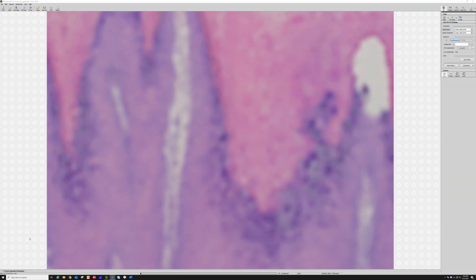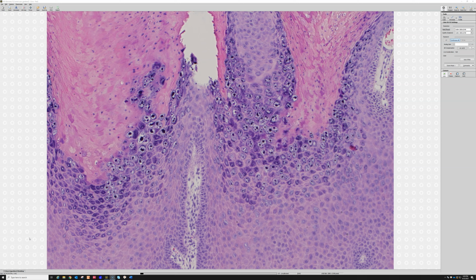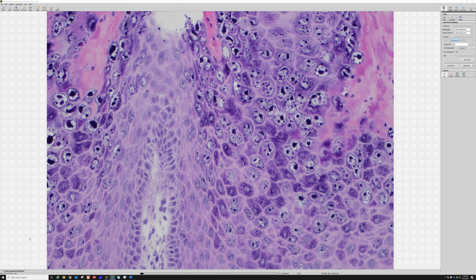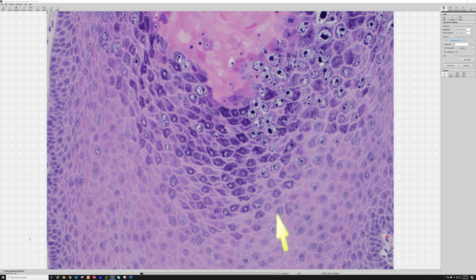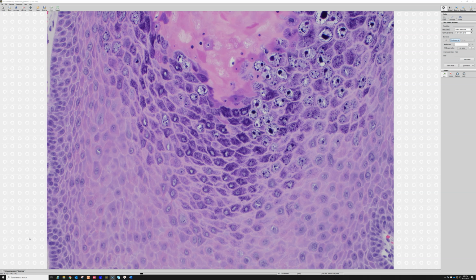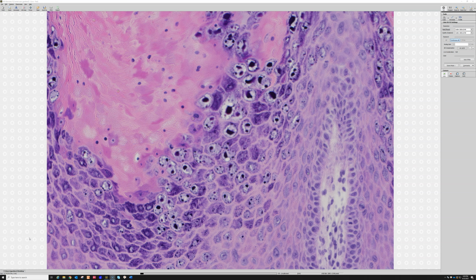So the granules here are massive, huge granules. And again, the granules are most prominent in the coilocyte cells. You can see the large gray nuclei here in the granular layer and the big coalesced granules. So I just wanted to show this one as an example of really dramatic hypergranulosis and massive coalescing of granules. See, there's the normal size of the granules, these tiny little powdery specks, and then here we've got these massive, huge things. So I'm not sure why the HPV makes this happen, but it's kind of cool looking, I think.